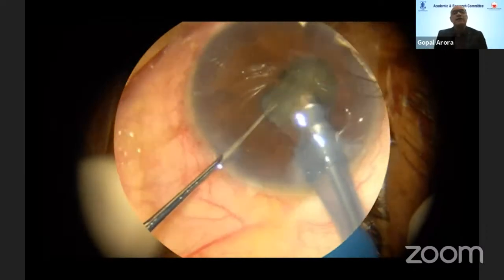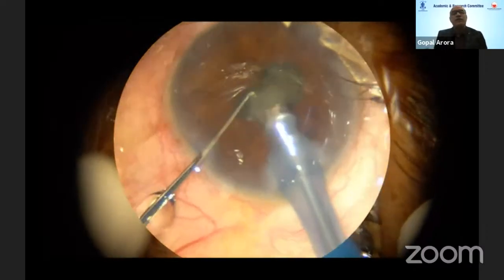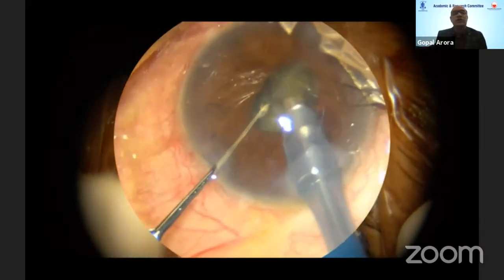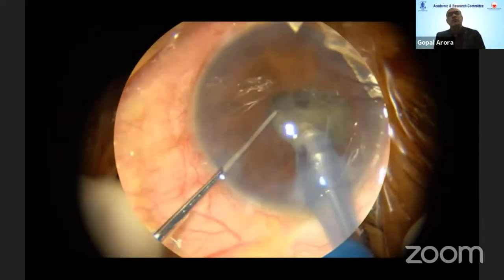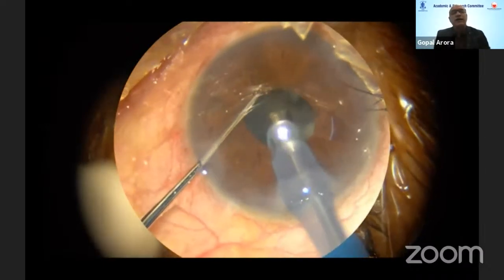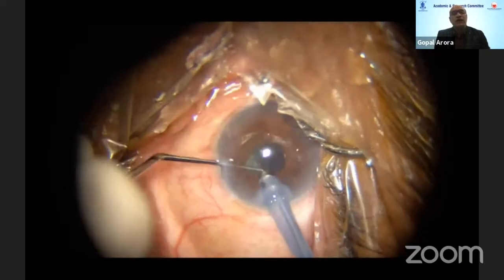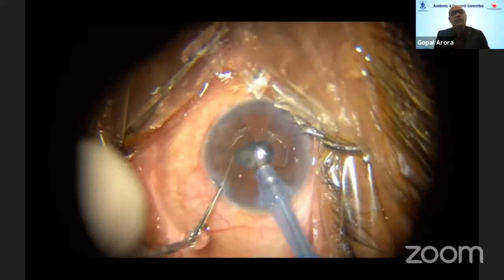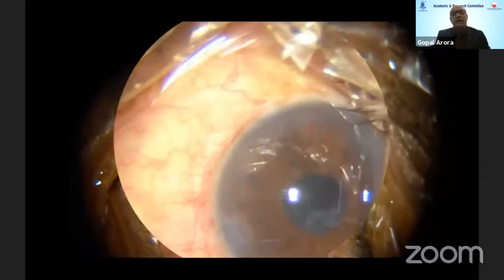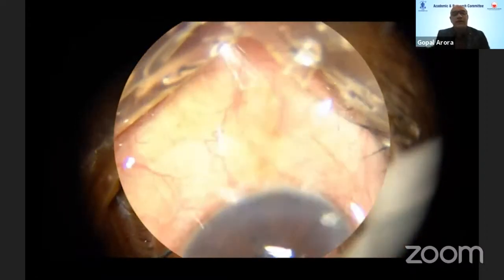Again, the key is you need to keep the tip of the probe exactly at the center of the pupil, that is within that 3 millimeter zone. And you can eat up each piece individually after you have separated the entire nuclear pieces from one another. As you can see, this is the last piece which is being eaten up by the probe, and there is the epinuclear plate being left.